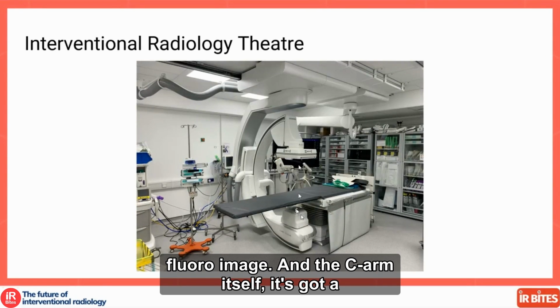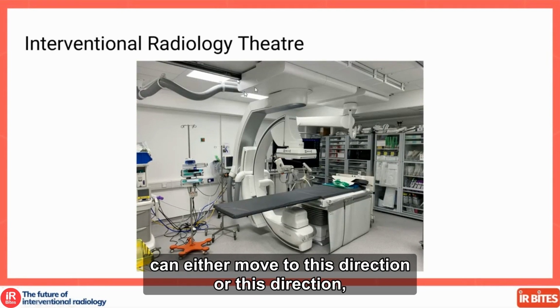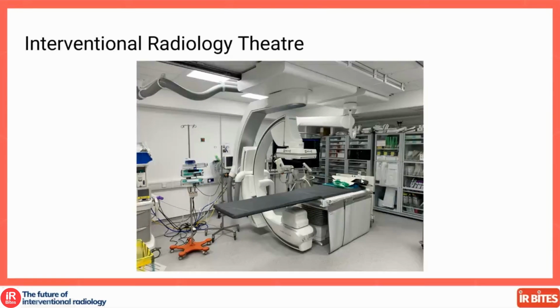And the C-arm itself has a field of movement. If you can see this, that's the railing on the ceiling, and this whole machine can move in this direction or this direction, depending on which part of the body you want to image. And then this C-arm itself can rotate 360 degrees.